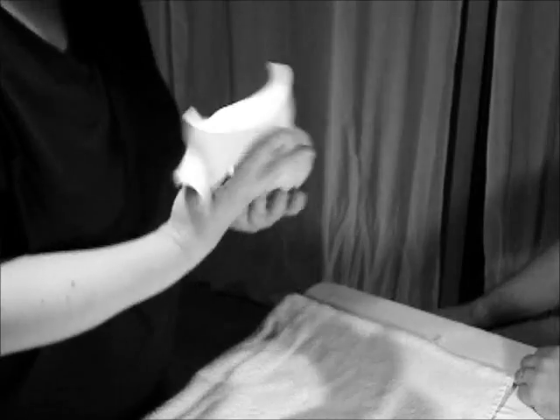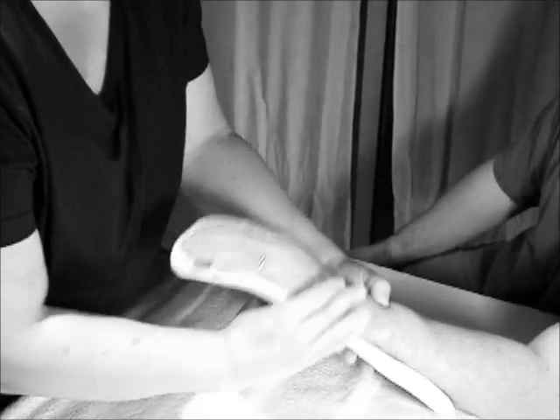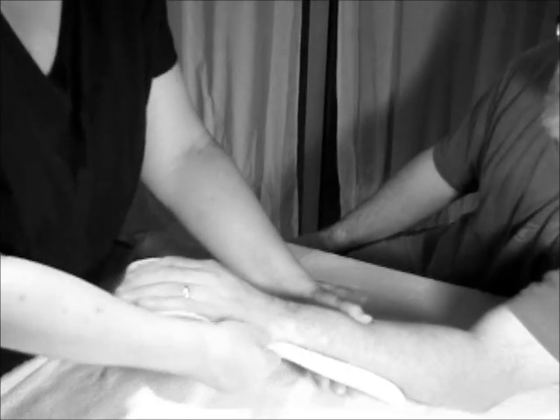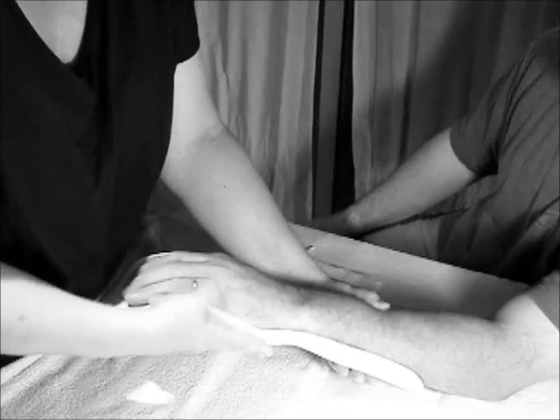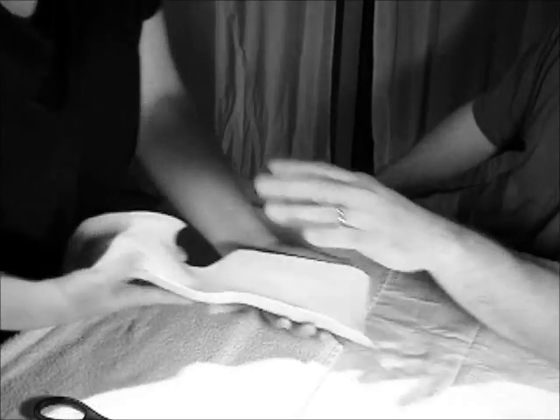Doesn't exactly fit my hand. Let's go ahead and try that. Good. So that's the most important position that you have him in, to make sure that he's comfortable there. That's poking into him there, so you can easily roll that out. Okay, you can come on out.